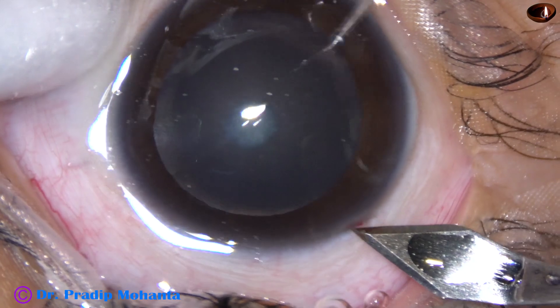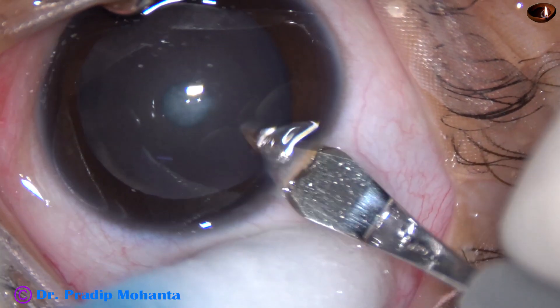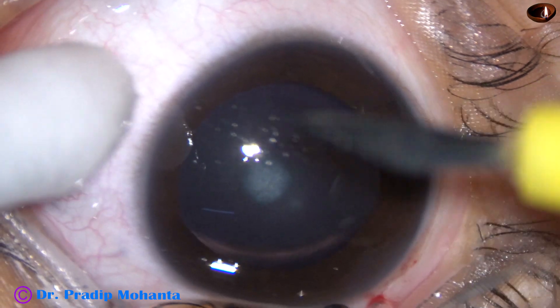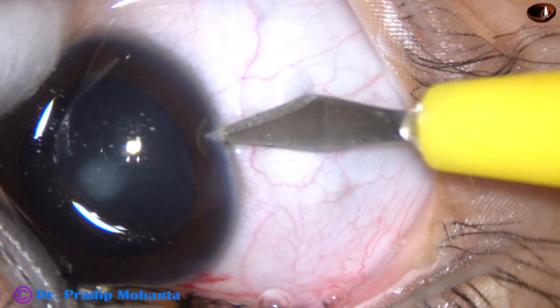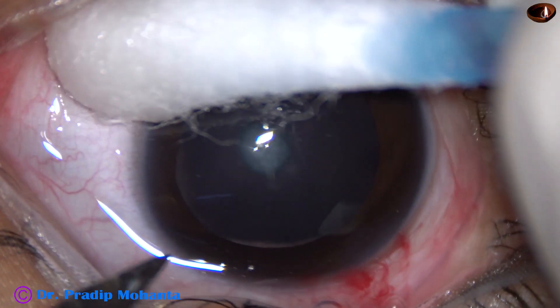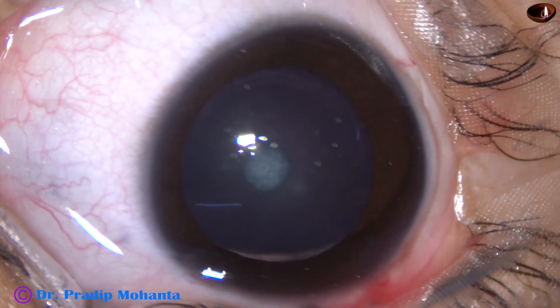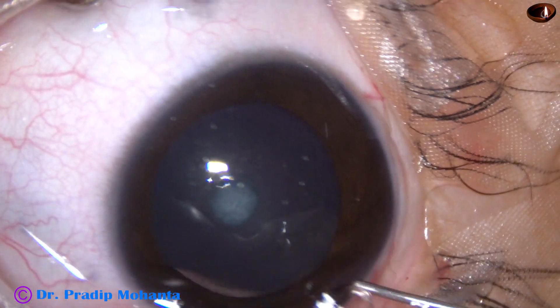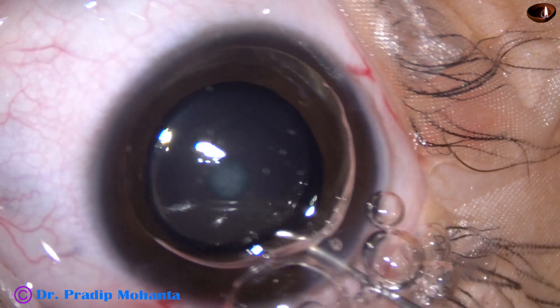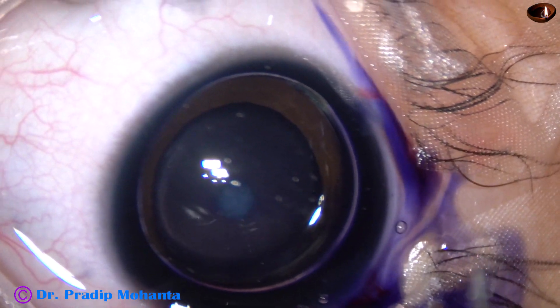This is the main incision on the posterior aspect of the limbus with a 2.8 millimeter keratome. We can see some blood oozing out from the lips of the main incision. Now this is a small side port on the right side of the main incision, and this is another side port on the left side of the main incision. This side port has been placed on the anterior part of the limbus, and now an air bubble has been injected into the anterior chamber. This is trypan blue 0.06% dye being applied over the anterior capsule underneath this air bubble.